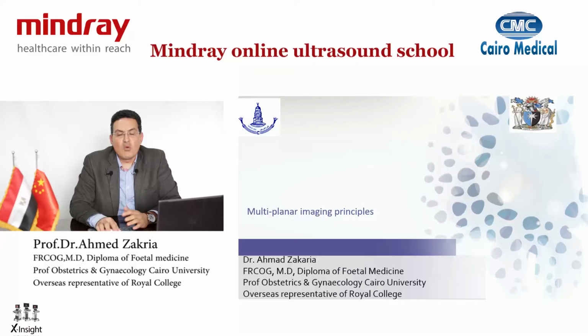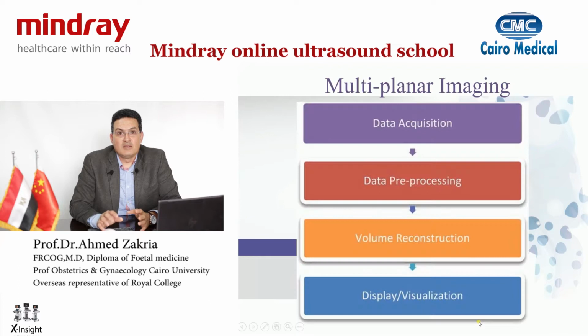I'm a consultant in fetal medicine, a specialist in the field, and I chose a topic which I hope will be interesting, where I'm going to be addressing how we can get into multiplanar imaging and 3D and 4D ultrasound imaging. My main objective with the lecture is to teach you how to set a target and learn how to reach that target and get a good image of it.